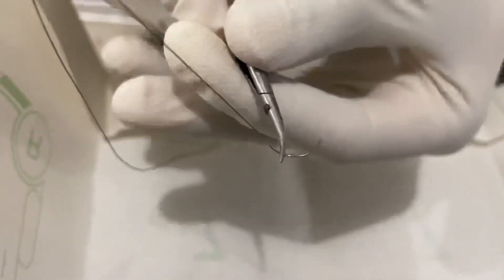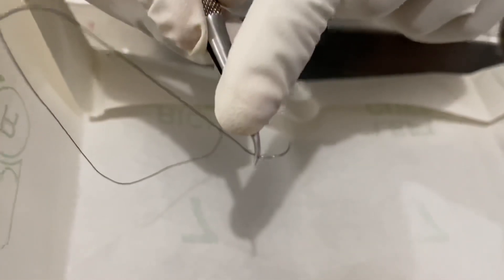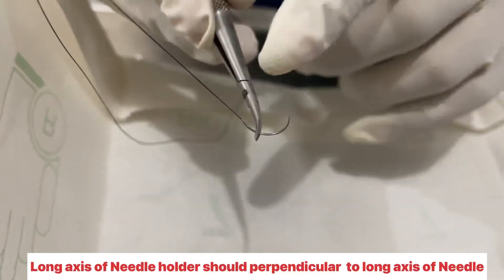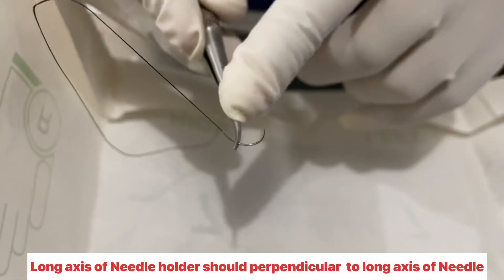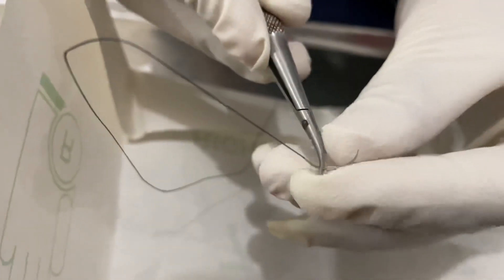So now you can see that this is the 2/3 portion and this is the 1/3 portion. The rule is that we have to keep the needle holder perpendicular to the needle, like this.